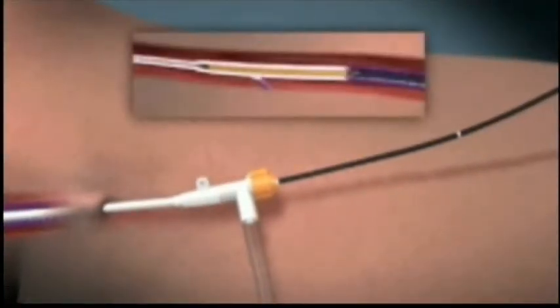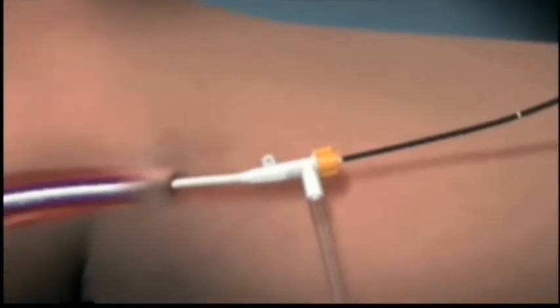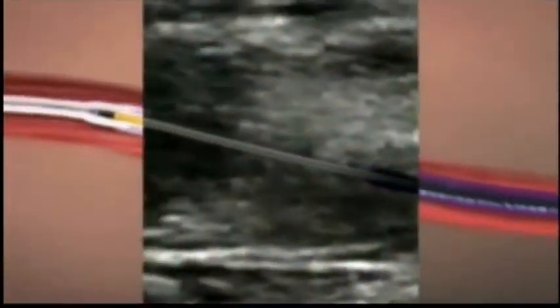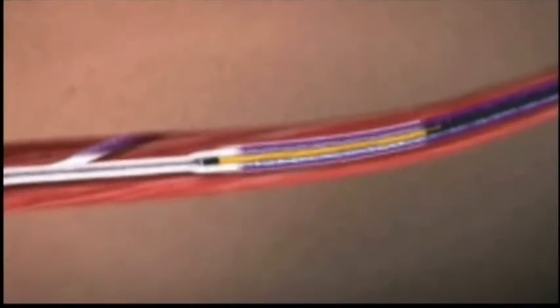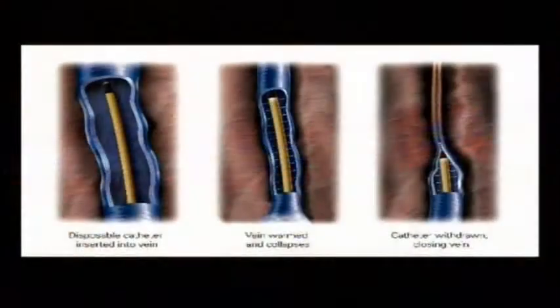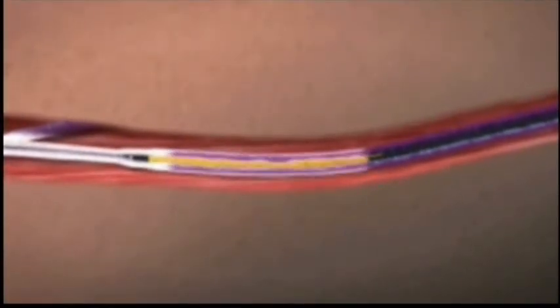We numb the vein up some more from the outside and use the energy of that to scar down the inside of the vein. Most of the veins have problems where the blood is going the wrong way and it's sliding back down towards the foot with gravity, and that makes the varicose vein so much worse. But if we use the energy of that catheter to destroy and scar down the inside, that vein shuts down and the varicose veins are either totally eliminated or we can do a little touch-up work later on. But it's a big change in how quickly they can go back to work, and the amount of overall discomfort. It's only Tylenol after the procedure.